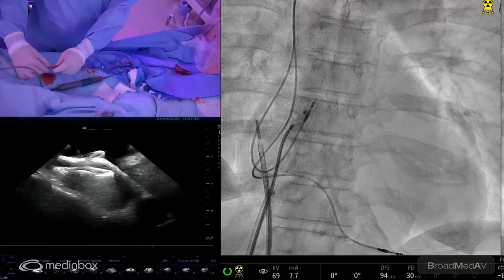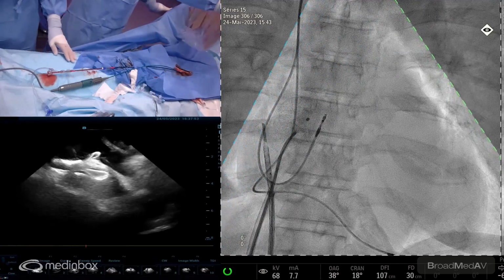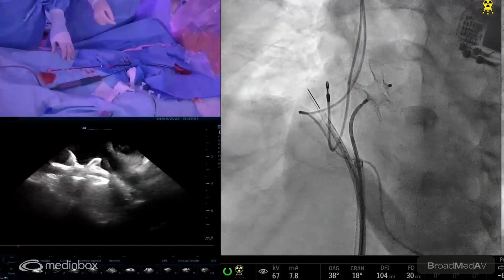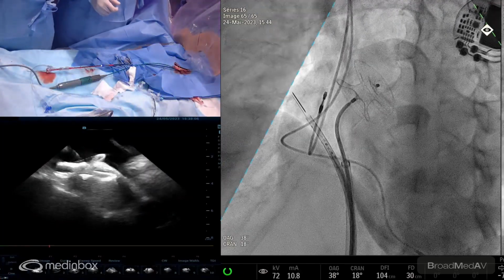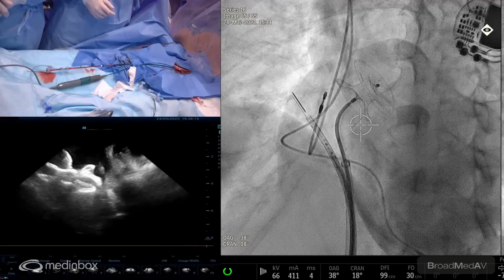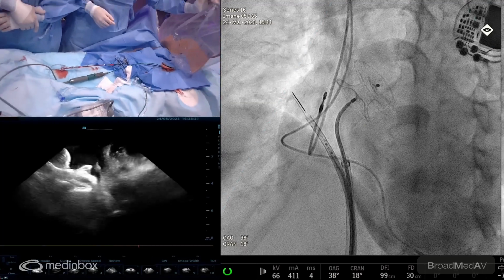So, yeah. And now we are AP, but we can go LAO and typically cranial to profile well the septum. I will show you what we will see by doing this. We should probably align more the septum. And see, it's perfectly aligned now. You see that the left disc is bigger and the right disc is smaller because we chose here an atrial septal defect occluder. At this point, I'm quite happy by what I see on echo and the fluoro. I think we can consider to detach.